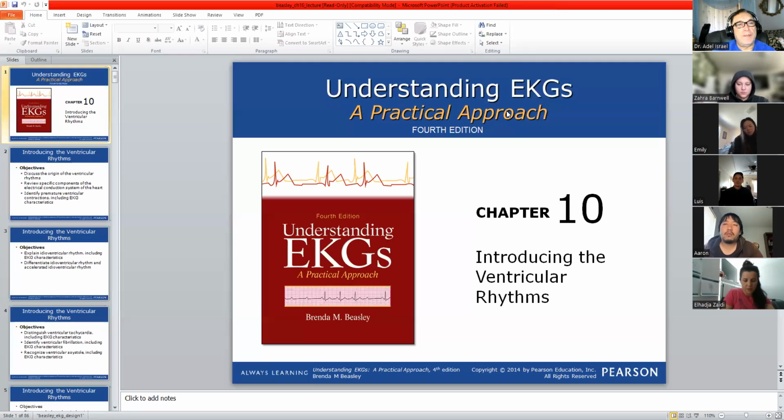Today, in this lecture, we are going to talk about ventricular rhythm. And as I mentioned to you before, you have to link between what you are understanding, what you are reading, and what you should interpret in your memory.